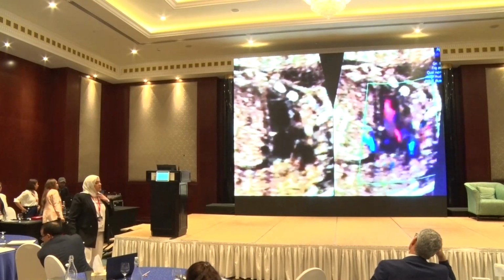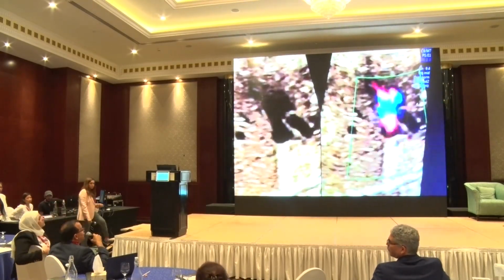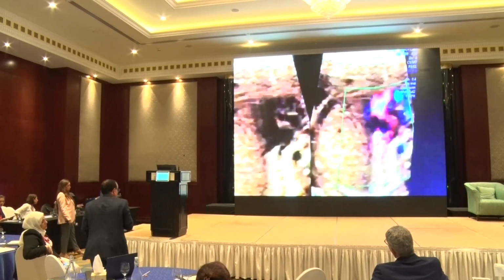What do you think, Dr. Diana? Yeah, I think I agree with you. And what beautiful pulmonary veins that you showed, very nice, entering the left atrium.